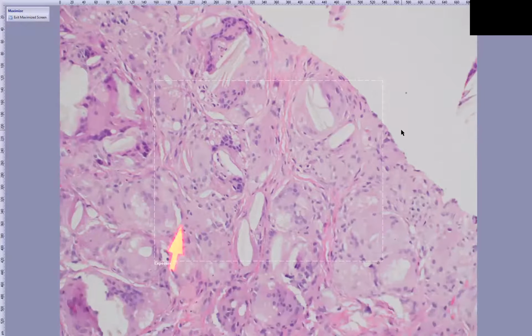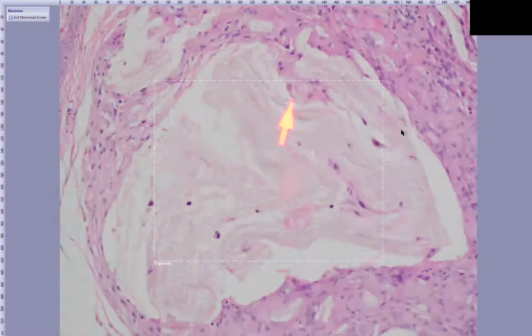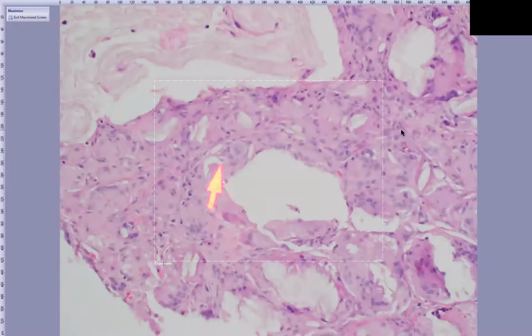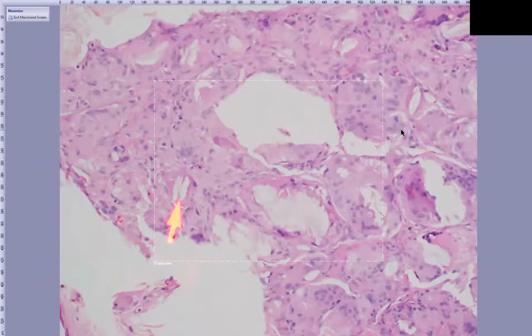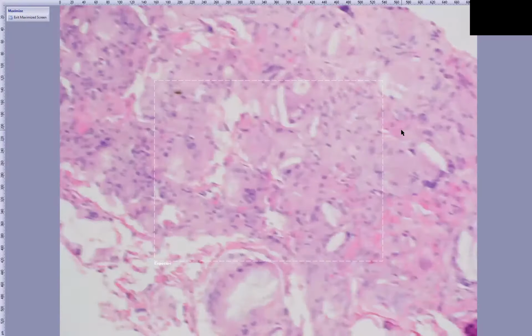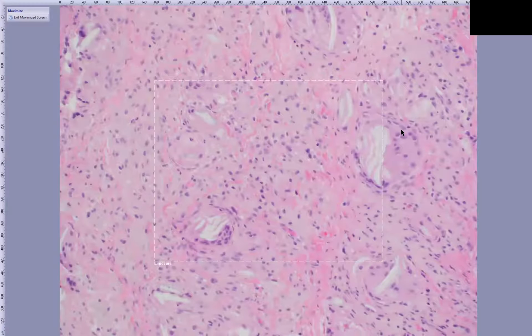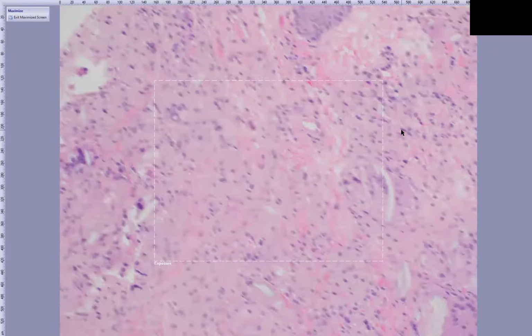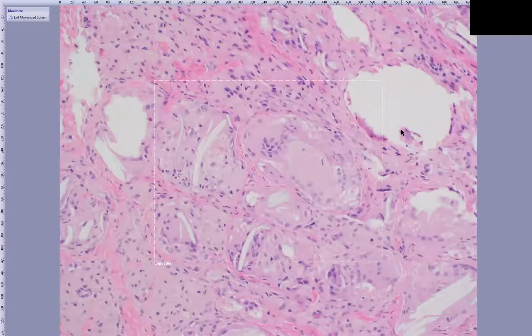So these needle-shaped clefts are not cholesterol clefts. They're actually keratin fragments. And here we have this huge blob of keratin. And then the giant cells are trying to engulf the keratin. So you'll see varying sizes of keratin fragments in the cytoplasm of these giant cells. And this is a keratin granuloma. Okay, so there must have been a ruptured cyst or a ruptured follicle with extrusion of keratin, and then you've got your granulomatous infiltrate coming in to clean up afterwards. So this is a keratin granuloma.